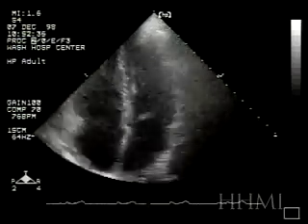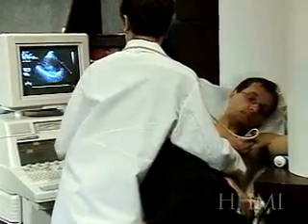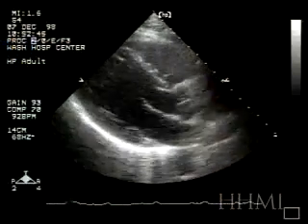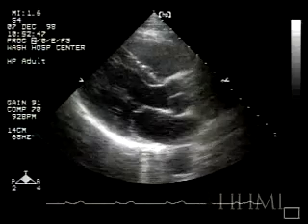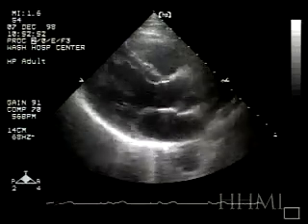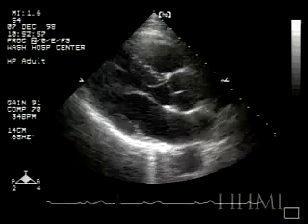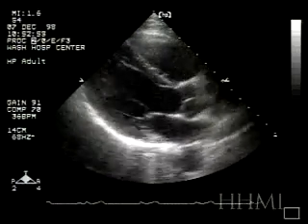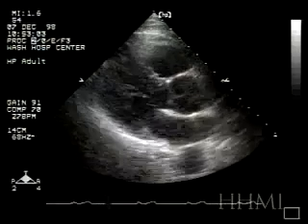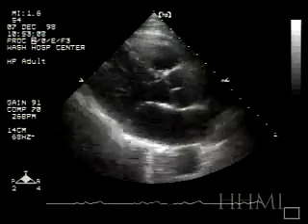If we go to a parasternal long axis view, we can look at the heart in a different direction. Now, as is shown in the previous schematic, with the head up here, the feet down here, and we're looking at the left atrium, the mitral apparatus opening and closing. Blood traverses from the left atria into the left ventricle and exits through the aortic valve. This white structure that appears and disappears on the screen is the aortic valve opening and closing.